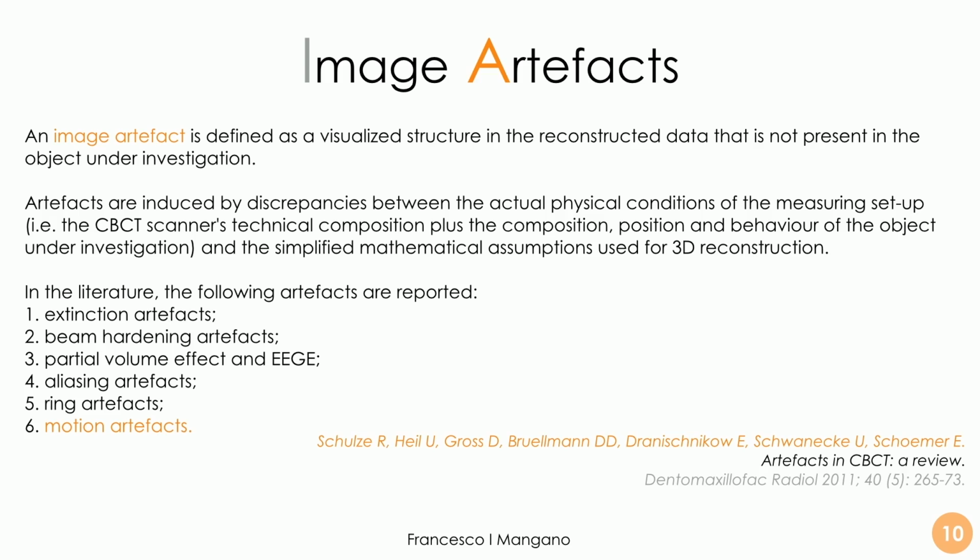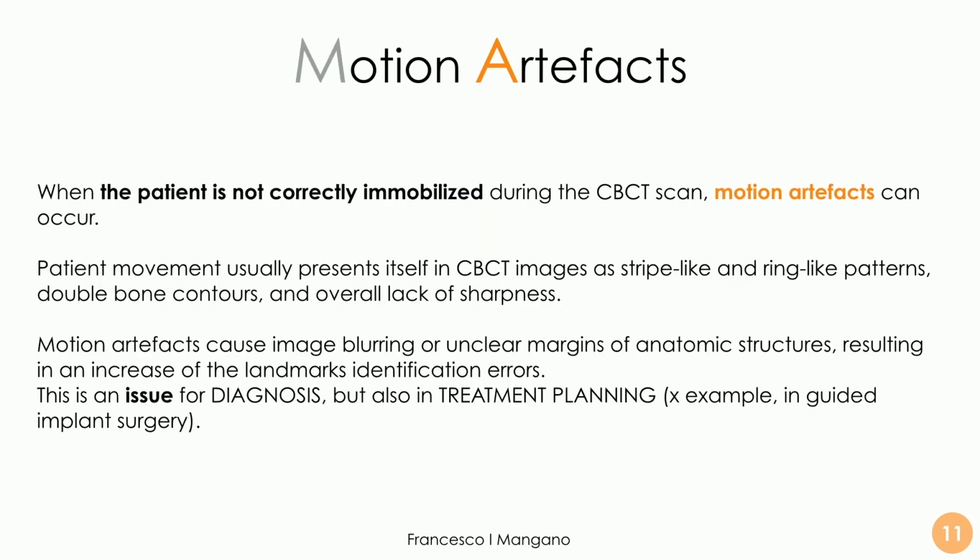I will focus my attention mainly on motion artifacts, so on the importance of proper patient positioning and of avoiding movement of the patient during the scan, because all these artifacts can potentially jeopardize our diagnostic capability, but the motion artifacts are probably the worst, because they really can create a situation that makes it not possible for us to make the proper diagnosis, and particularly to proceed with some treatments, like for example guided implant surgery.